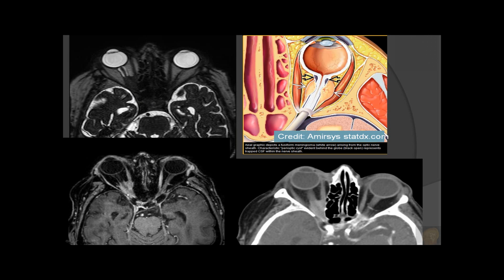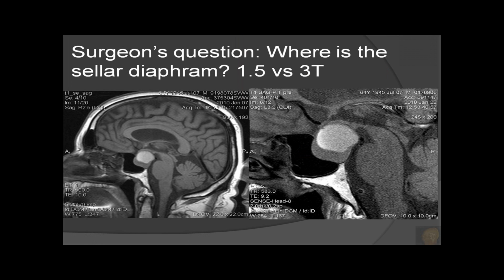Pretty much, a contrast enhanced MRI study shows the same information as the contrast enhanced CT study, except you see more of the optic nerve and the nerve sheath. You can separate them apart. That's called soft tissue differentiation. Even with contrast, you have trouble telling them apart in the CT study. So MRI is better for evaluating soft tissues, but bone is better with CT. You see the septation within the ethmoid air cells, and it's hard to see anything here. It's pretty much all black. So they complement each other.